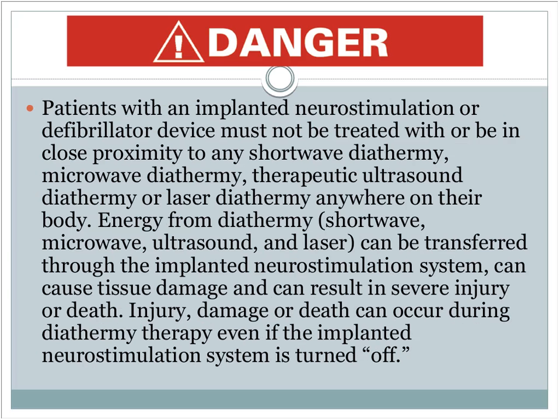Even if the neurostimulator system is off, you can affect it and stimulate something that you're not supposed to. So just be aware of those things, know those things, and these people shouldn't even be in the room while you're doing diathermy on somebody else. They should not be very close when you're doing ultrasound on somebody else. Probably safest to say the same type of precaution on that. Don't have them in the room while you're doing ultrasound.